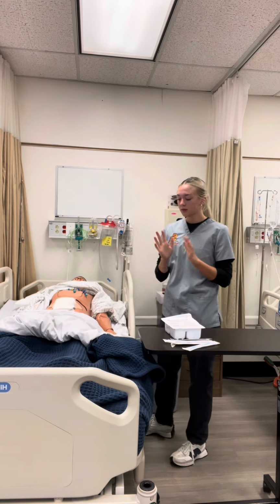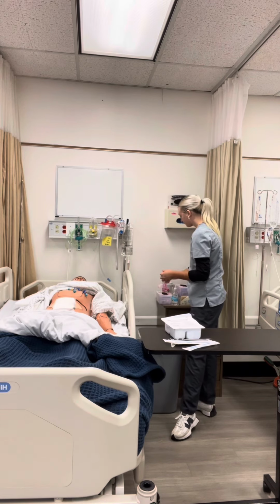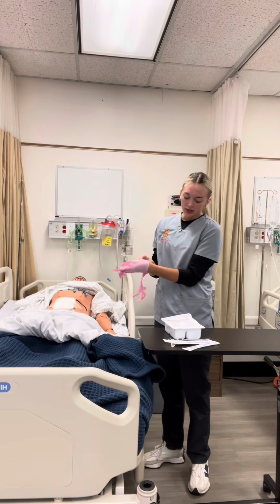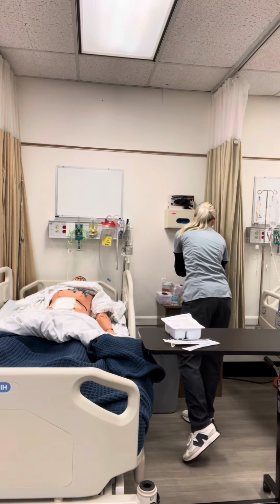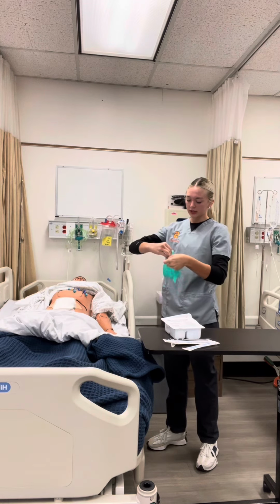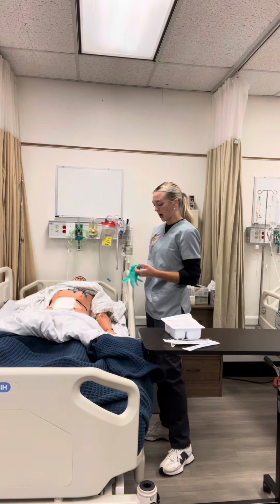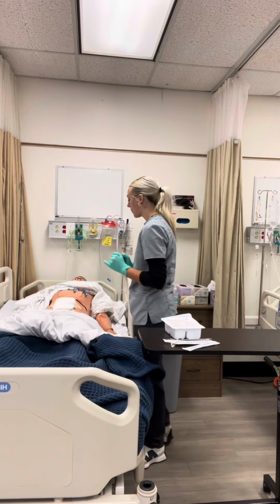Alright, so I've performed hand hygiene and I'm going to put on a set of clean gloves. I've gathered my supplies. I have some cotton swabs, a measuring tape, and a dressing change kit. And I also have a trash can at my side. So I am not going to take the red bag out of my kit.